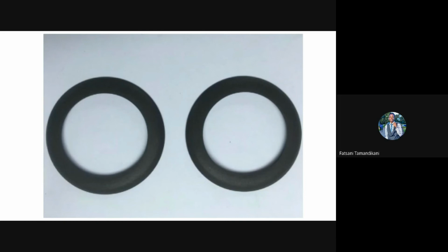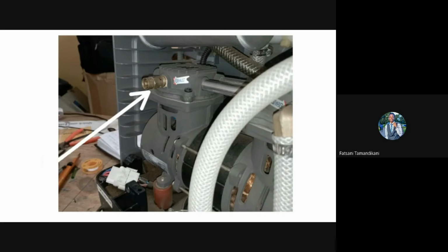The other pressure that we're going to look into is the relief valve pressure. A pressure relief valve is a type of safety valve that is used to bleed off excess pressure in the system. The relief valve is designed to open at a specific set pressure and is typically installed to protect the compressor and other concentrator components from stress that could result in failure if the intended operating pressure is exceeded. The pressure at which the relief valve is triggered is called cracking pressure.